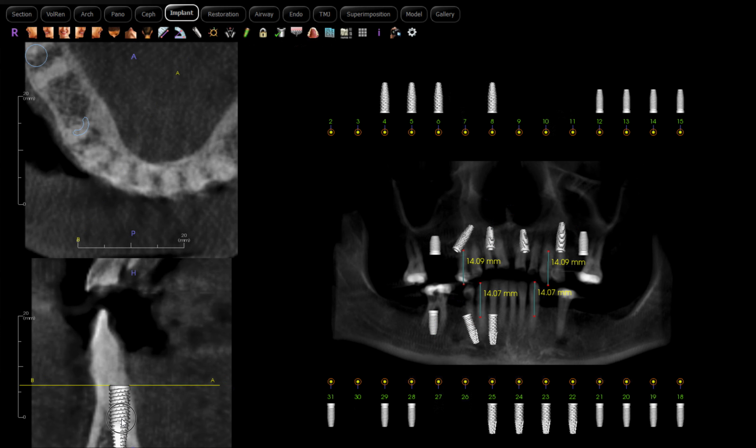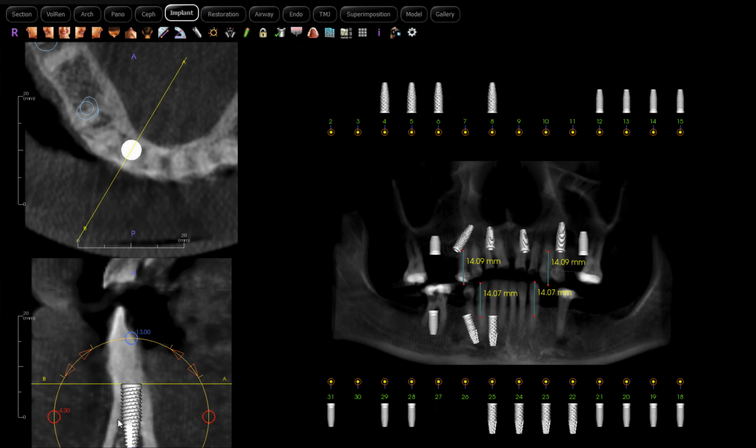Alright, as I place this implant, we're looking a little thin on the bone. I have to see when that tooth comes out if the buccal plate stays intact and we can graft that, then I'm probably comfortable putting a 4.3 diameter implant here. But I will be prepared with a smaller diameter, 3.5, just in case, so we can stay well within the bone there. With 3.5 by 13 and 6 implants on the lower arch, I'm still plenty comfortable with the amount of support we'll have.